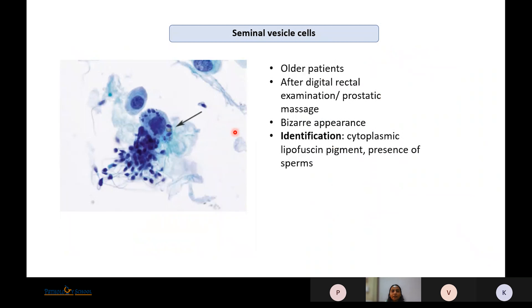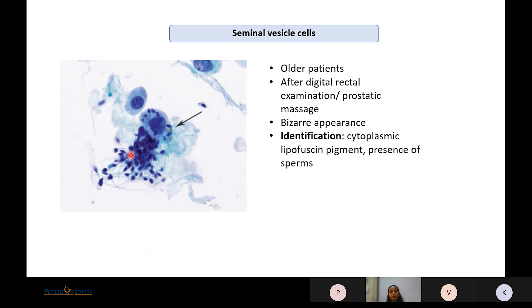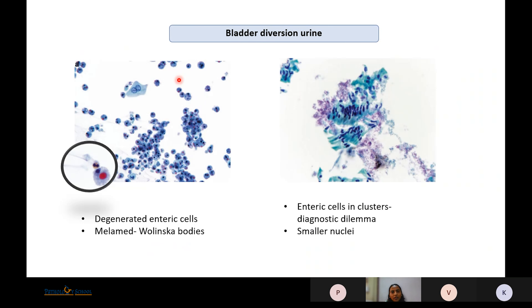Seminal vesicle cells can be present, more commonly seen in older patients after digital rectal examination or prostatic massage. They are bizarre-looking cells, but the presence of lipofuscin pigment and sperm are identifiers for seminal vesicle cells, so they should not be labeled as atypical cells.